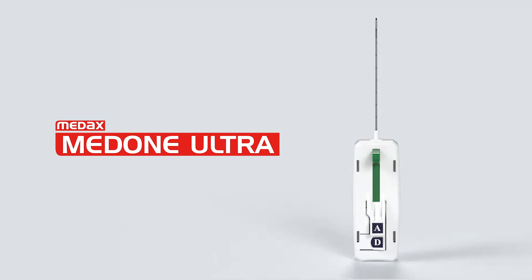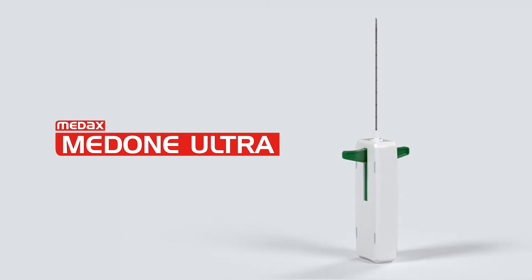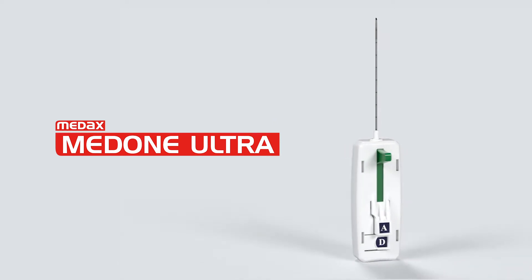MedOneUltra is a programmable, automatic, disposable biopsy system especially dedicated to calcified and fibrous lesions.